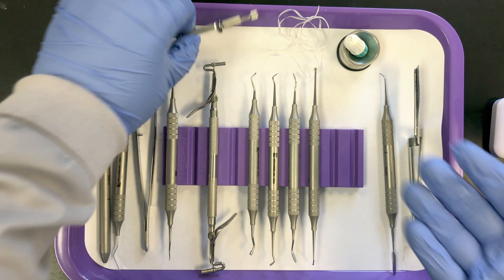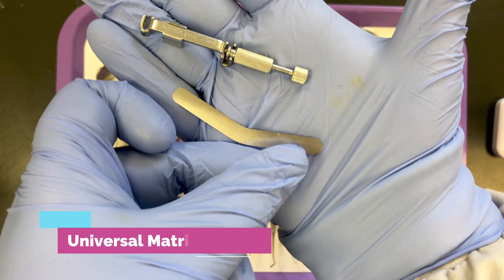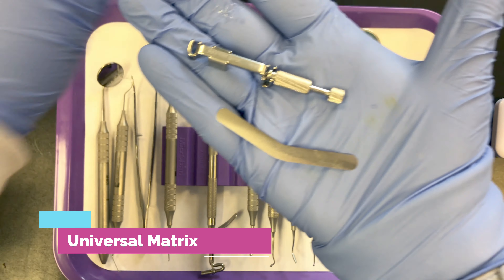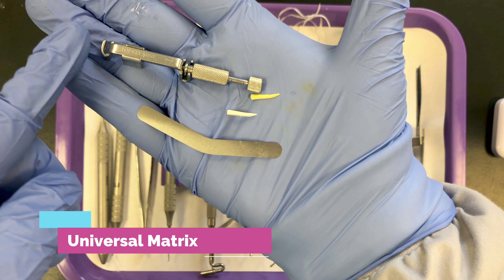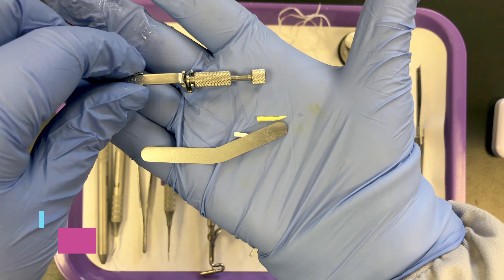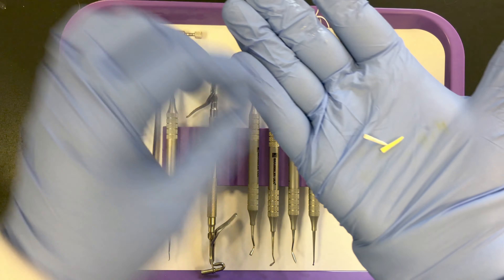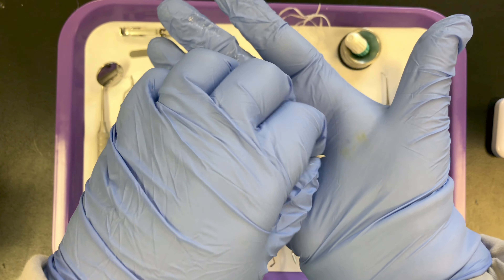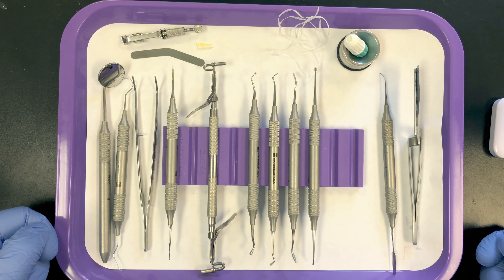Up here on the tray I have a universal matrix retainer, universal band, and wedges. You would only need to set this out if your amalgam filling involves a proximal surface. We would know that ahead of time based on the patient's chart and treatment plan.